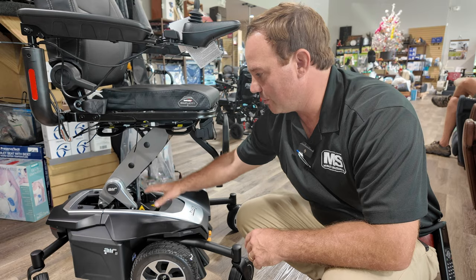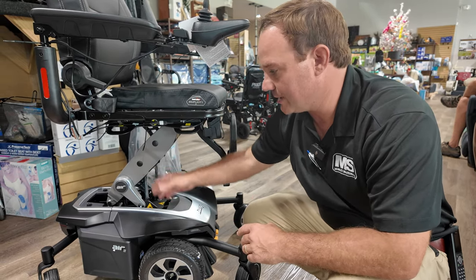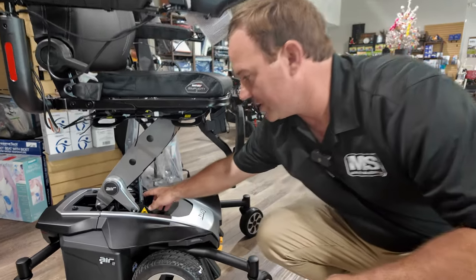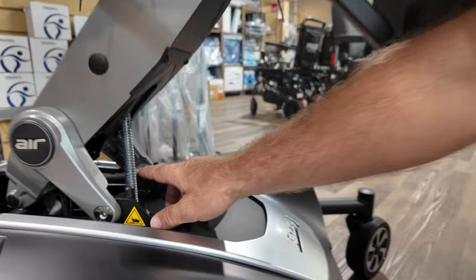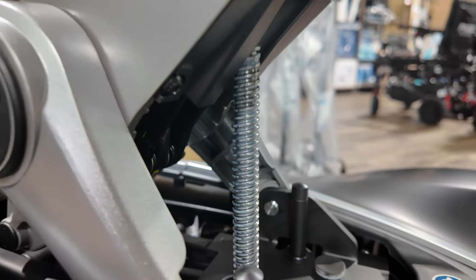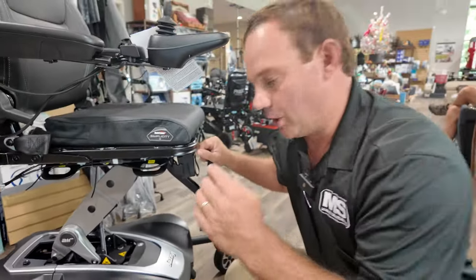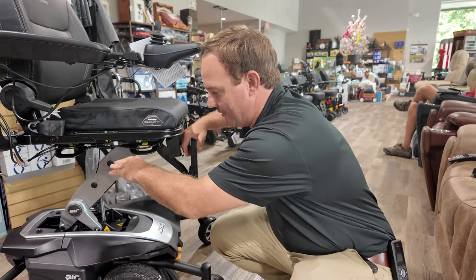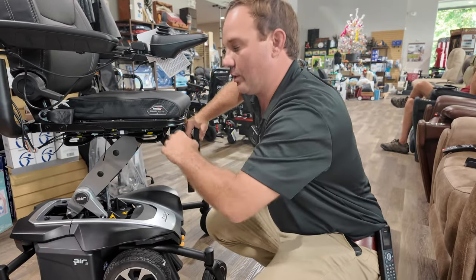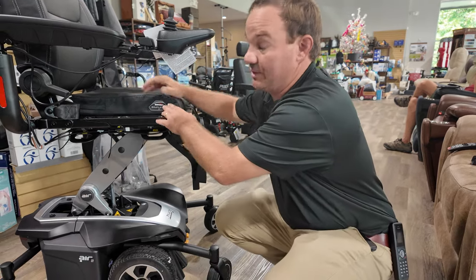When the Jazzy Air first came out it had a different setup. This is the Jazzy Air 2 — it's been out for a while and comes in many different colors, this is black onyx. They put a new drive system in it because most power chairs with elevated seats have a floor-to-ground that's too high for shorter people. This allows it to get more flushed down so the floor-to-seat height is lower.